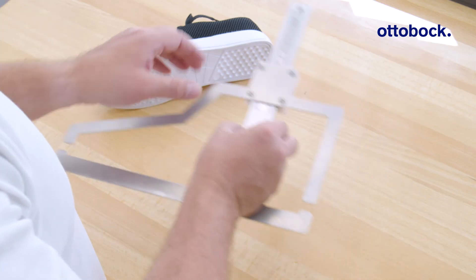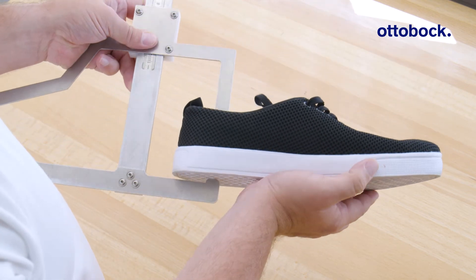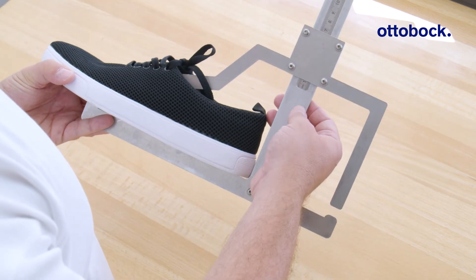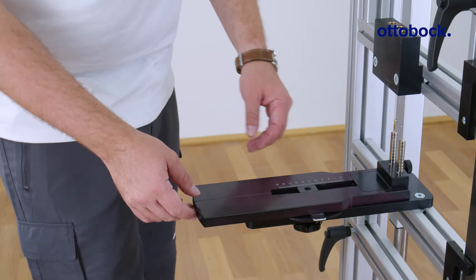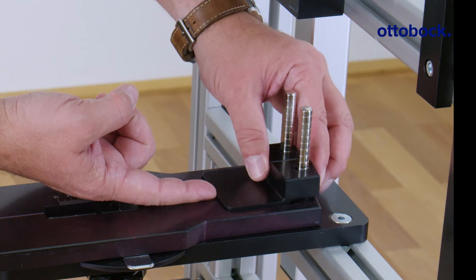First, determine the effective heel height of the user's everyday shoe. For this, measure the heel height of the shoe and subtract the sole thickness at the forefoot. Then set the heel height plate to the effective heel height plus 5 additional millimeters.